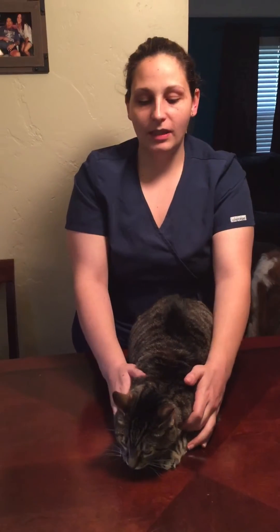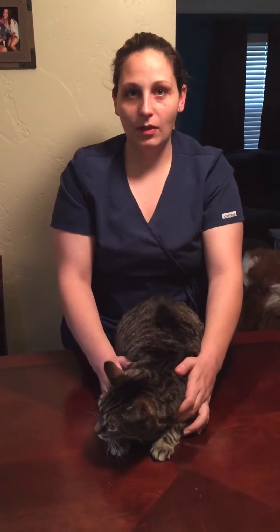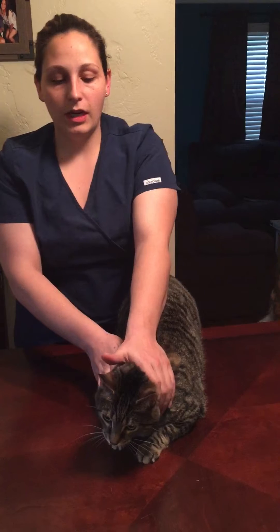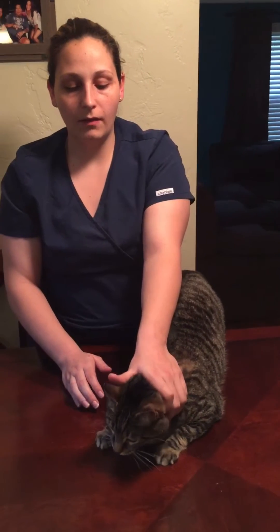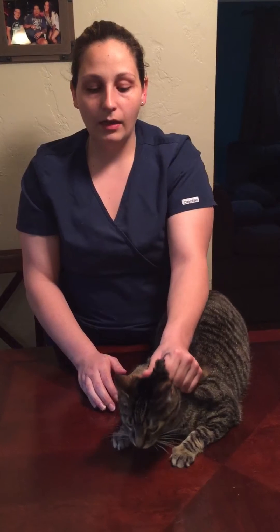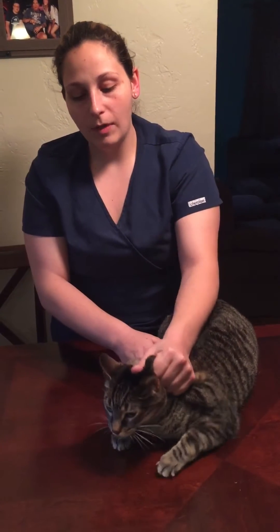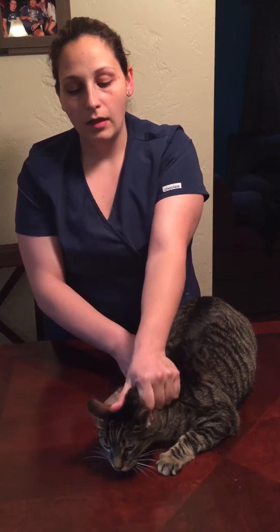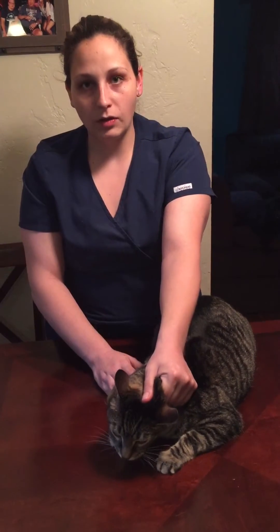First, I'm going to demonstrate the proper way to collect blood from a cat from the saphenous vein. The most important part of this restraint is the scruff. Obviously you don't want to get bit and you don't want your other technician to get bit. It's important to make sure you have a good scruff on the cat with your thumb pointing towards the front of its face — more rostral.